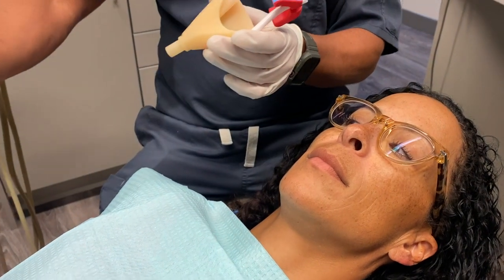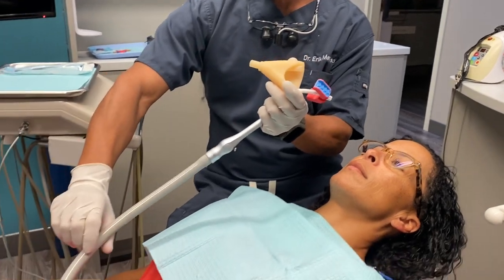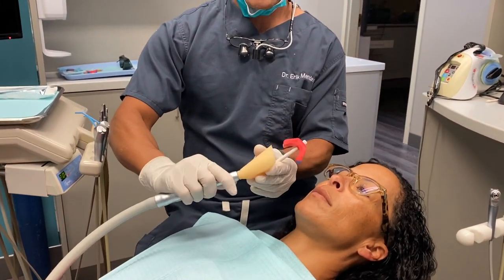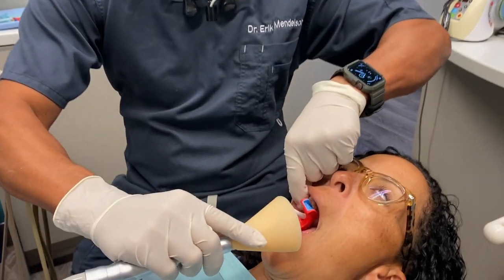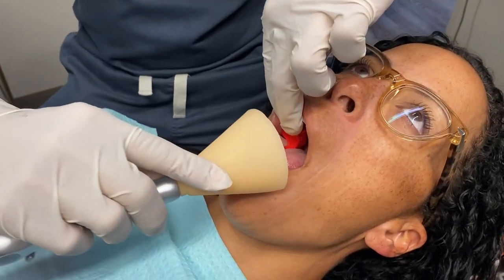Then we're going to take our HVE and have the patient just kind of rest your arm on there — not grip it, just kind of holding it. Insert the Solovac into the HVE, open, and then bite down for me.